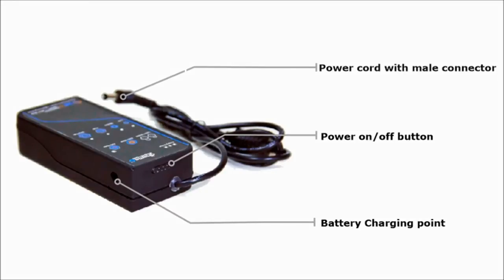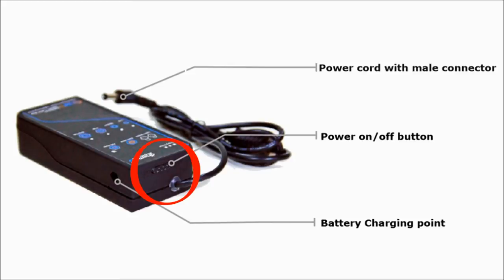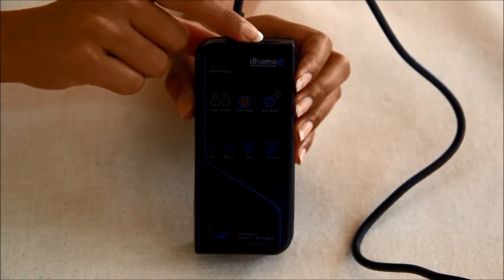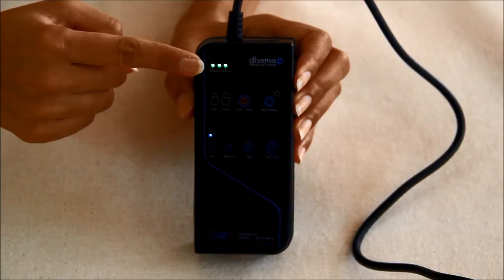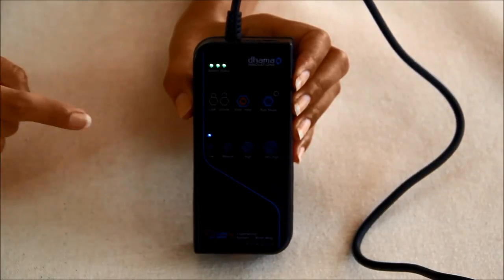Let us take a look at the parts of the touch controller and battery unit. It has a power cord with a male connector — never try to insert the power cord male connector into the battery charging point, as this will permanently damage the control unit. Slide the power button located on the top side of the touch controller and battery unit to turn on the system. As soon as it is switched on, the LEDs indicating battery status will start to glow, and cooling level low and manual mode will be turned on by default.